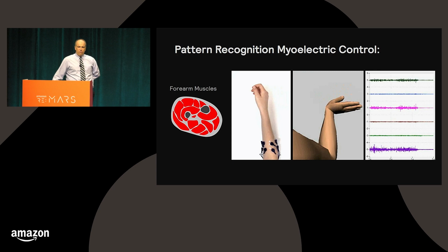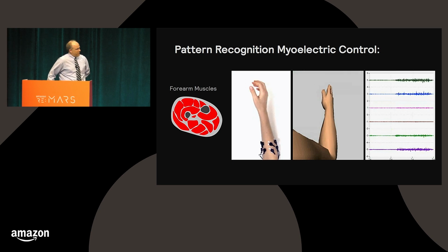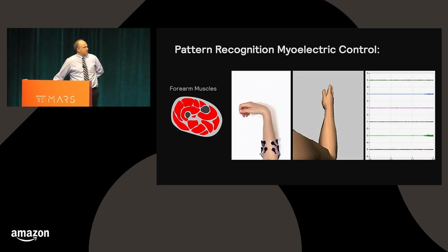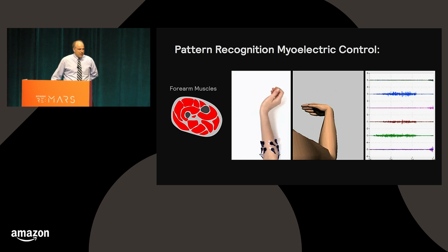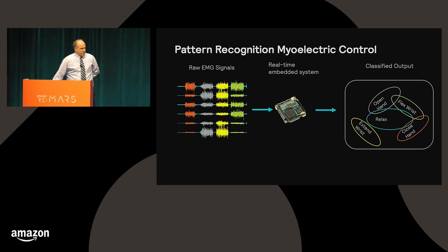And so we can decode movements at the wrist, we can decode finger movements. It really just depends on the sophistication of the decoding algorithm. This video is a bit dated, maybe 5 years old, but it illustrates the process of using this in real time to decode a virtual limb in this case. So the name of the game is you kind of have these very random looking EMG signals that are detected, amplified, and we use a real-time embedded system to transform the EMG signals from a random state into a highly structured, generally a feature space.